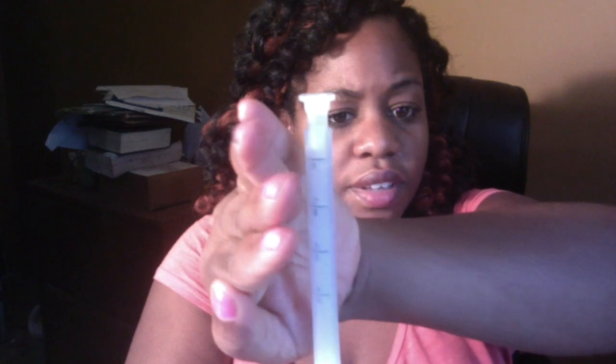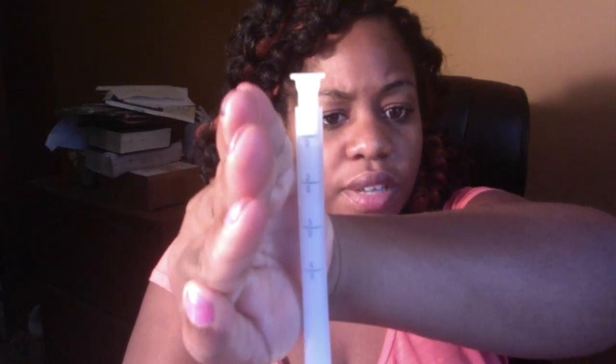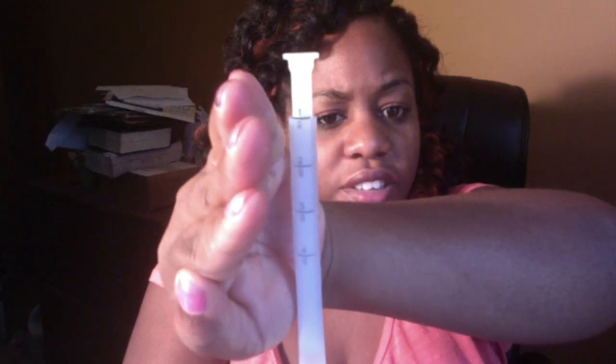It's a lot of lubricant. So what I did, if you could see how it is, it's really jelly. And you screw it on to the tip of the applicator, so it can hang together because it screws on. And I push it up to the point where it says a gram. You just push the top until it gets to 1 gram. And yes, you can see this is where the 1 gram is.